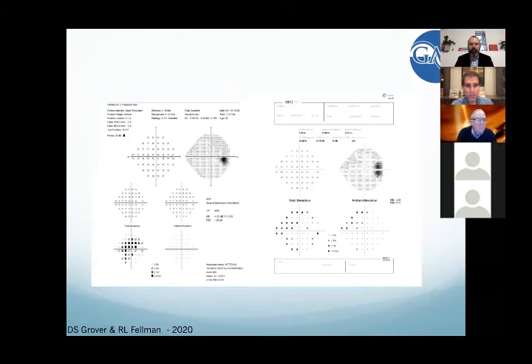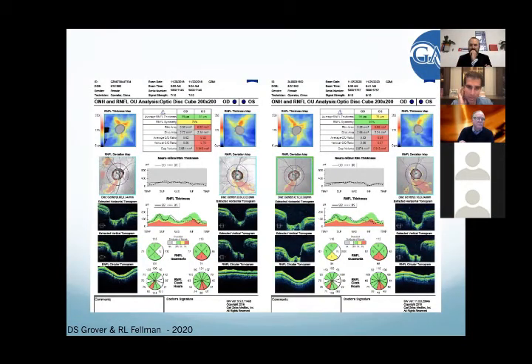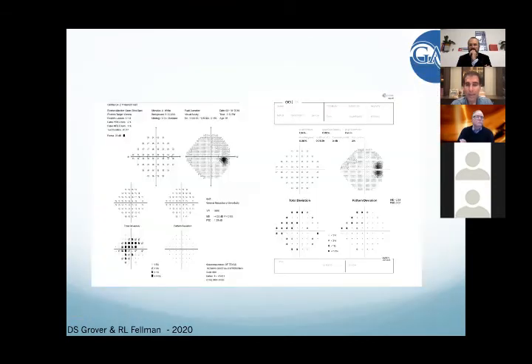This is her visual field machine from visual field testing in the right eye, March of 2019, to recently in the right eye with the VisuALL platform in the past couple months. And what's interesting is, again, if you look back at the right eye, that's classic glaucomatous optic neuropathy. You see loss of the inferior nerve fiber layer. You see a disc hemorrhage, and you can see loss in the inferior temporal quadrant. And then you'd expect to obviously see a superior defect.